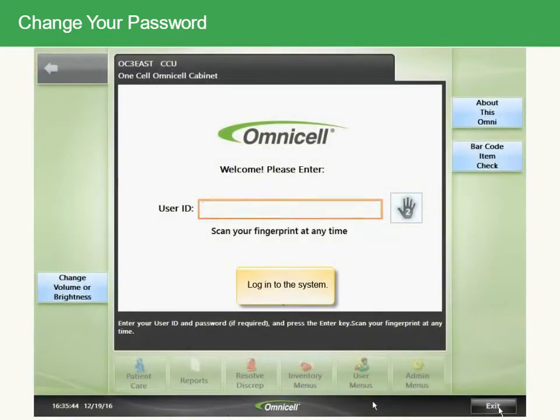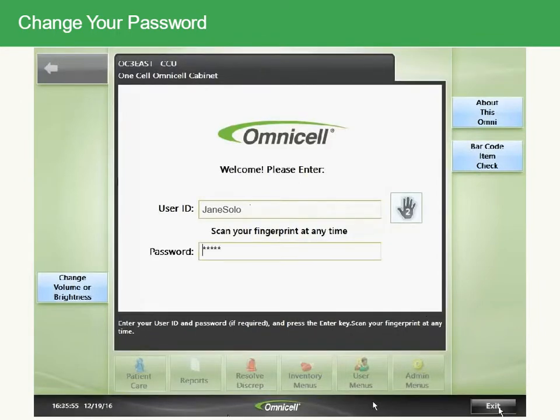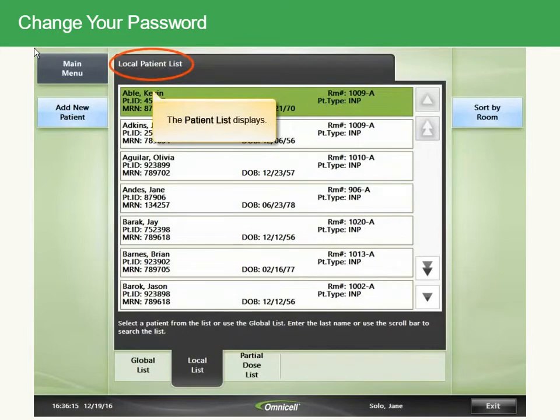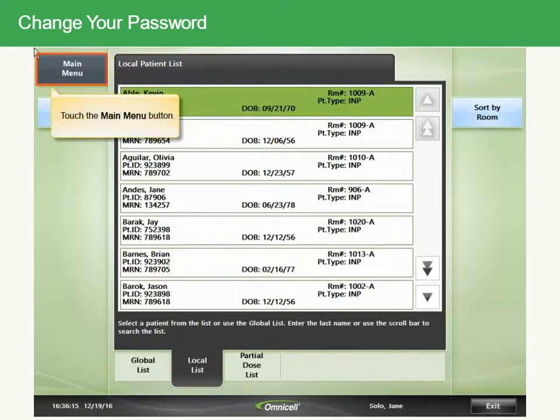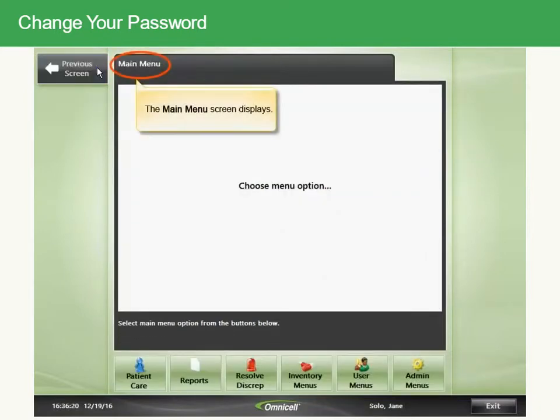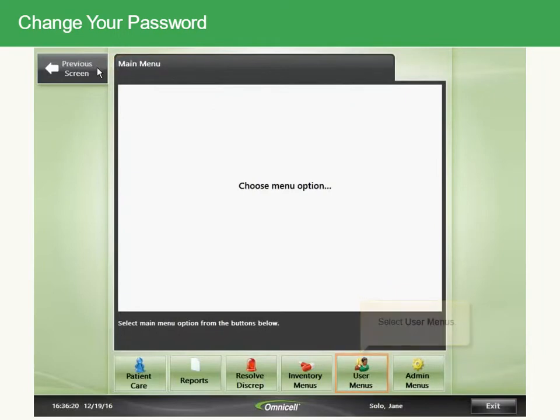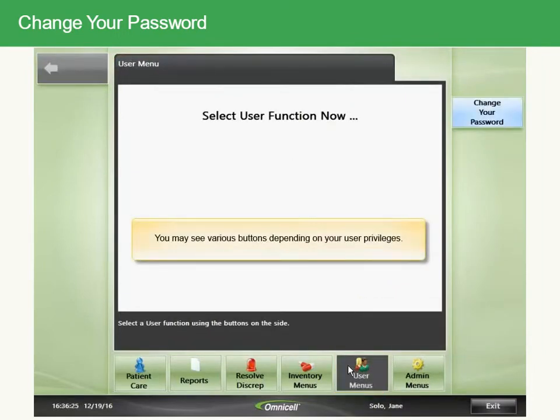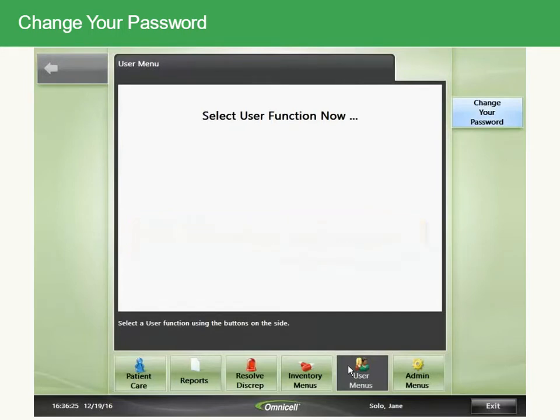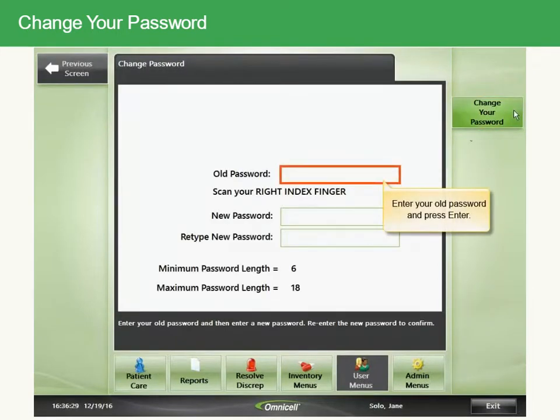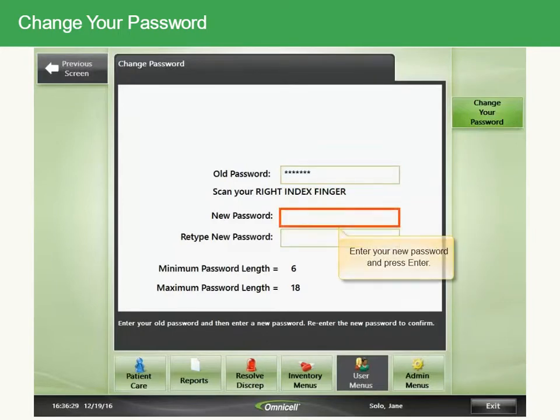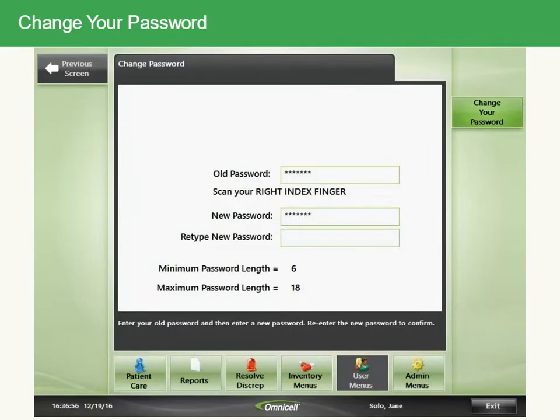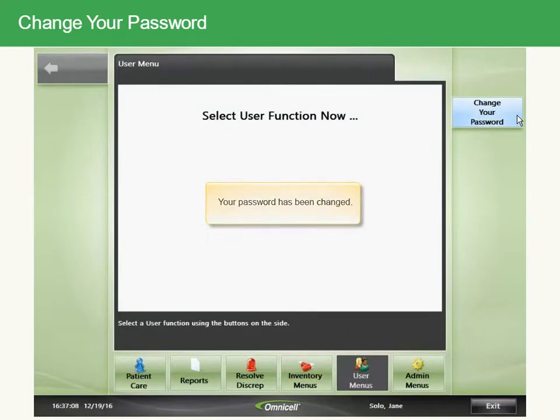Log in to the system. The patient list displays. Touch the Main Menu button. The Main Menu screen displays. Select User Menus. Touch the Change Your Password button. Enter your old password and press Enter. Enter your new password and press Enter. Retype your password, then touch the Change Your Password button. Your password has been changed. You can now log out.